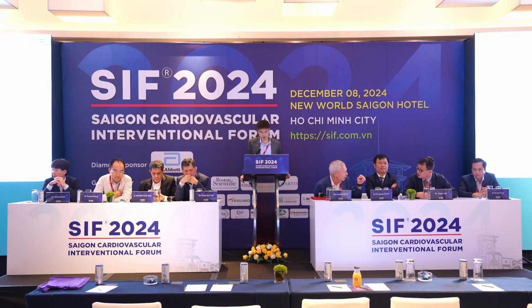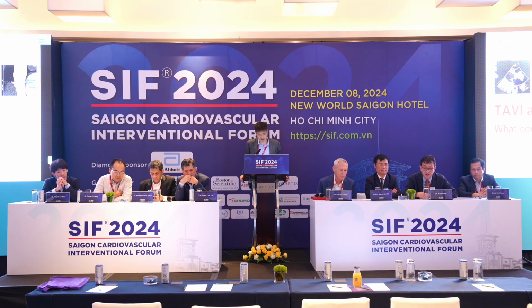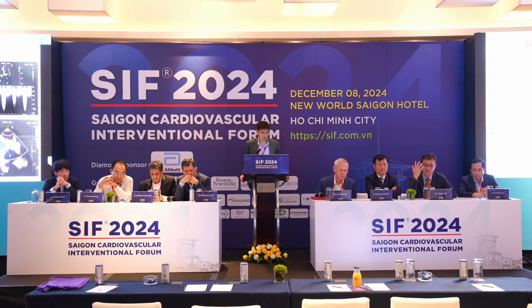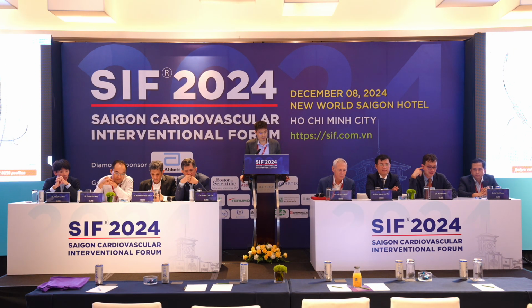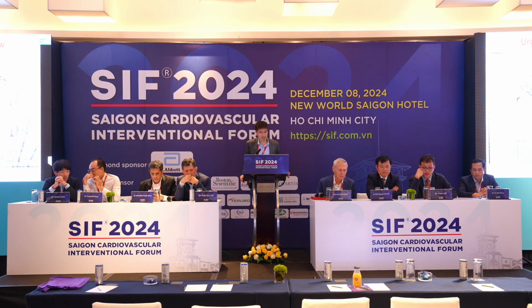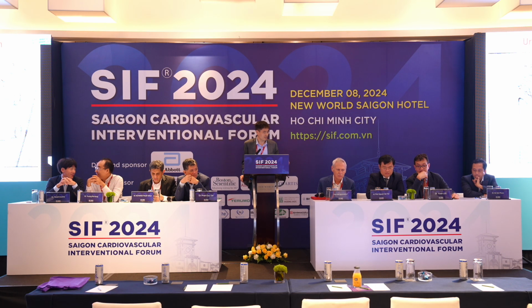I don't know what you would do, Eric, and other doctors. I had no idea what to do, but we decided to stop because the patient is quite stable. We get a good coronary flow, the hemodynamic is okay, and the leakage is very tiny. We stopped. And we decided to do the multi-slice CT after that.